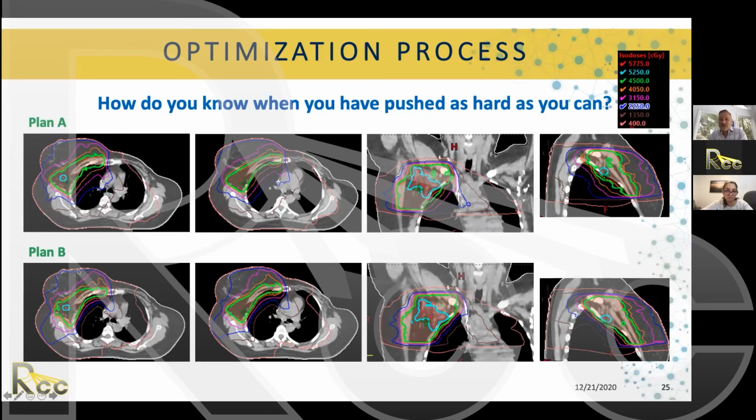And again, we can use the chat. You don't have to have the right answer. We have a response from Saad Saeed saying A, and then one from Lacter saying B. B, okay, we have a tie. So we can go with either plan then. Again, both plans are good. We can go with either plan because both met the target coverage and the OR constraints.